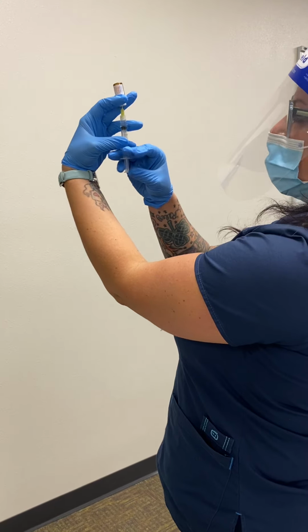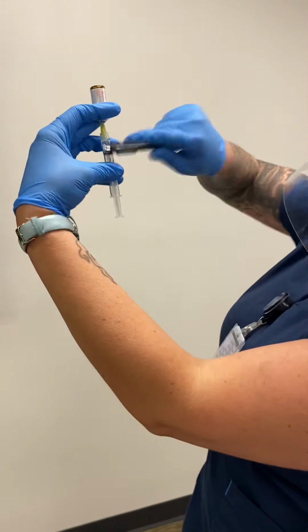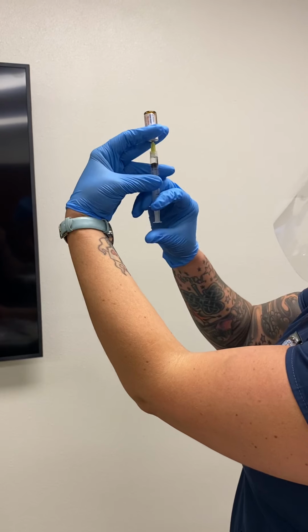You're going to go past your amount needed. And push up.